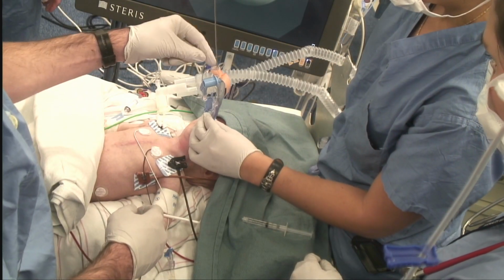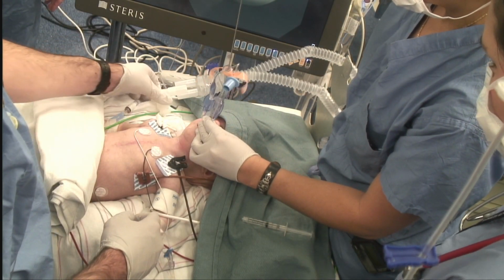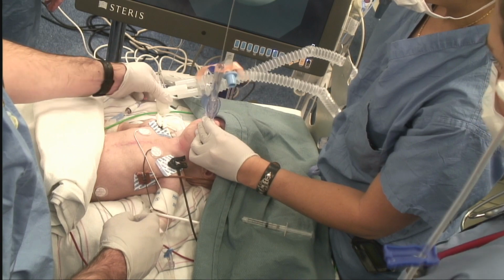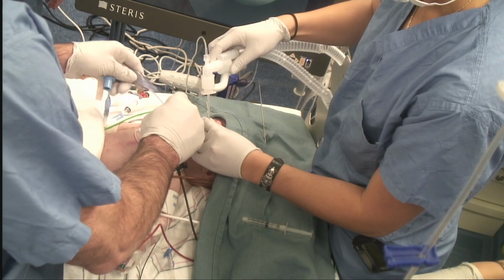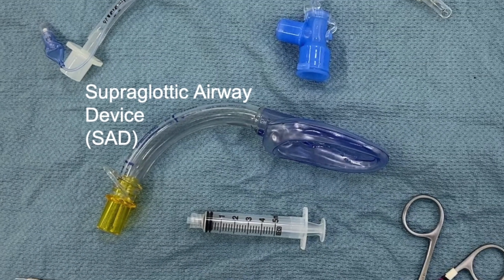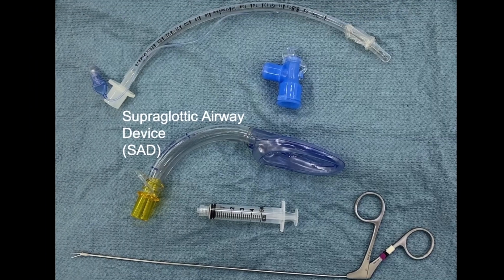The shorter conduit length also lets the provider grab the tracheal tube in the mouth as the supraglottic device is removed over the tracheal tube without needing to advance the tracheal tube further into the airway. The larger diameter of the airway conduit, together with removing the 15 millimeter circuit connector, will pass a lubricated pilot balloon even in a neonatal-sized supraglottic airway device.